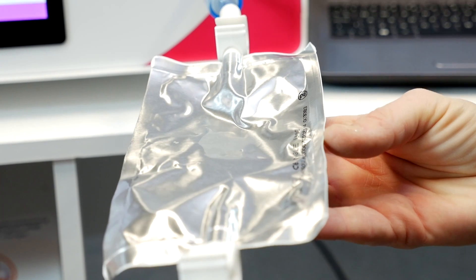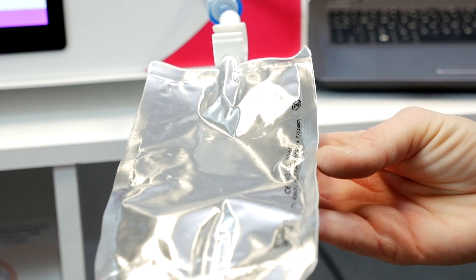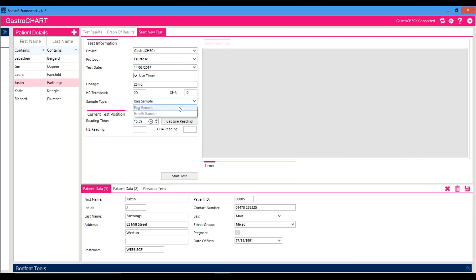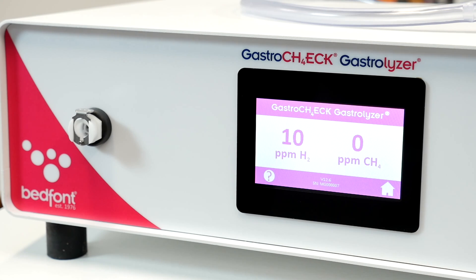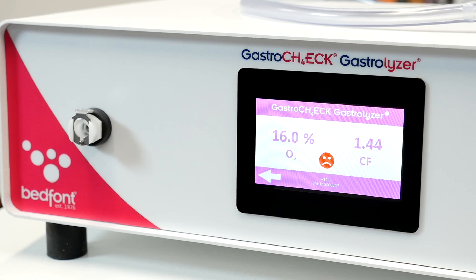An egg timer will be shown on screen once zeroed out. The Gastro Check will automatically begin bag sampling for 45 seconds, as indicated by a new egg timer and countdown. If you are using the Gastro Chart software to record the results, press Capture Reading Now. The final results will be shown on screen. Press the question mark for a visual indicator of the results. If you are recording the results manually, note them now.